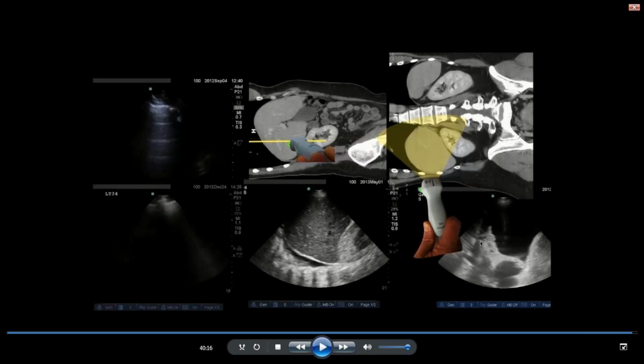So if you have that option, that is something to consider, because the enhancements allowed by those different presets change the appearance that you see on the ultrasound screen. And sometimes it's a subtle change. Sometimes it's pretty significant, and you can really benefit from a different shading, different clarity, etc.